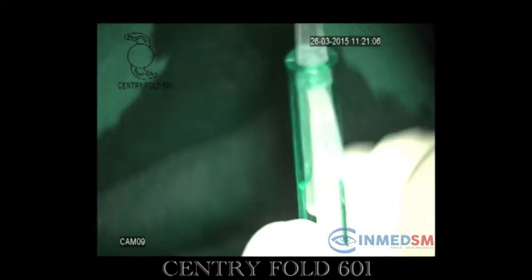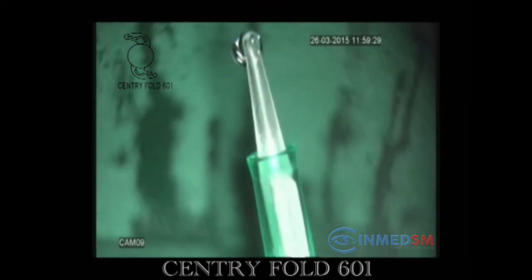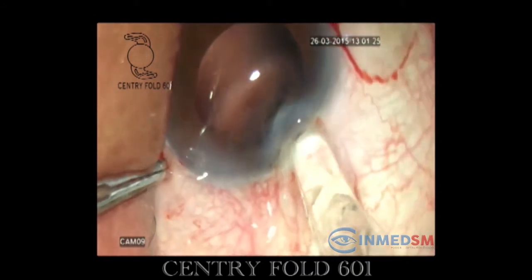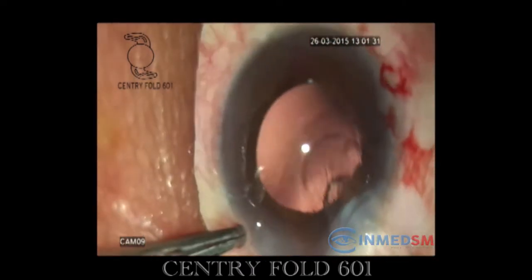The cartridge is loaded to its compatible injector and the injector piston is pressed slowly to release the excess viscoelastic material from the barrel. Simultaneously, the movement of the folded intraocular lens is checked under the microscope before entering the cartridge into the anterior chamber.